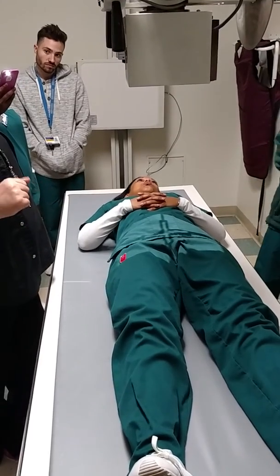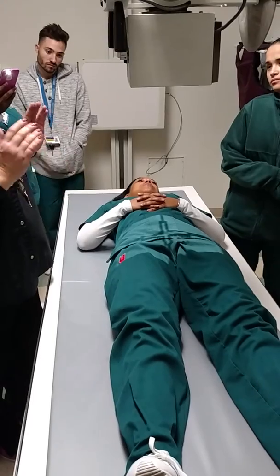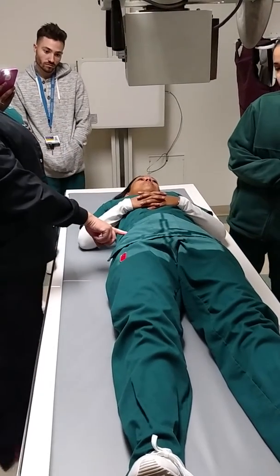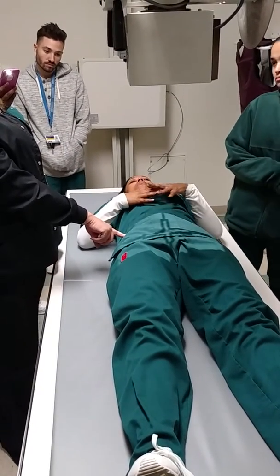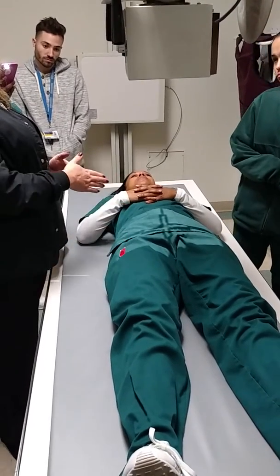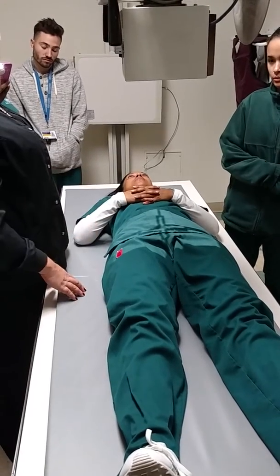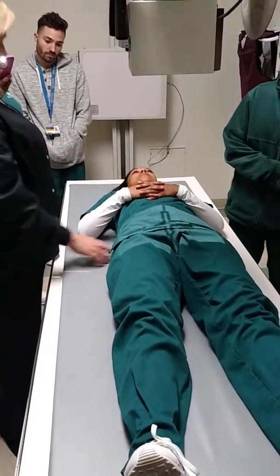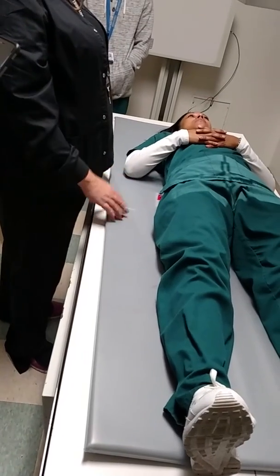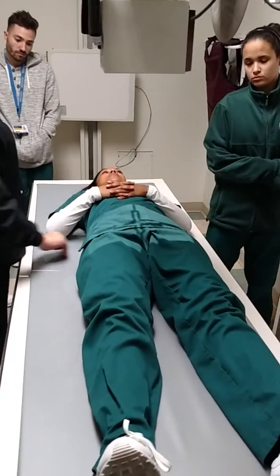No, if you don't get it in the thing you're looking at, but in your head you just have to go, I'm getting a pelvis x-ray, right? It's a pelvis, it's a pelvis. If I put it up here, that's probably going to get in the pelvis. If I put it down here, it's probably going to be on the femur. So you just got to think, what I'm looking at is up, so I'm going to put it down. Now, if she's skinny and you put it here, that's not going to be a problem at all. But most people are not going to have it, so you put it down.